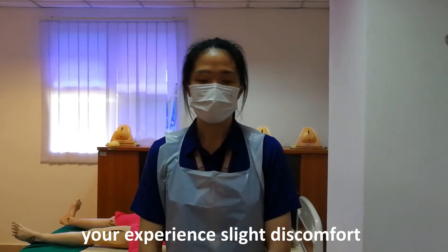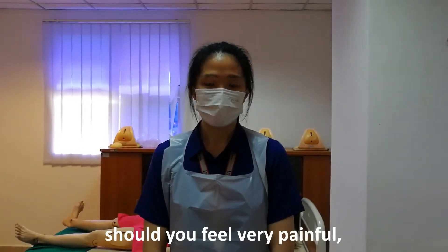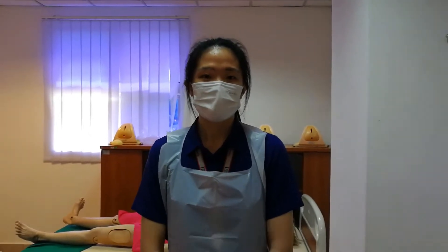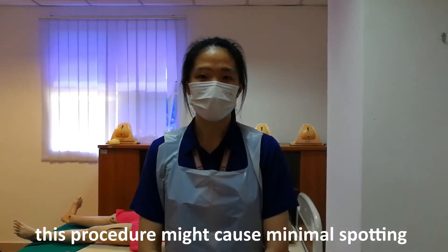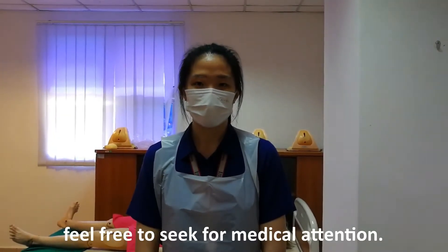During the procedure, you will experience slight discomfort and there shouldn't be any pain. Should you feel very painful, please feel free to tell me. For your information, this procedure might cause minimal spotting after the procedure. So if there is any heavy bleeding, feel free to seek medical attention.